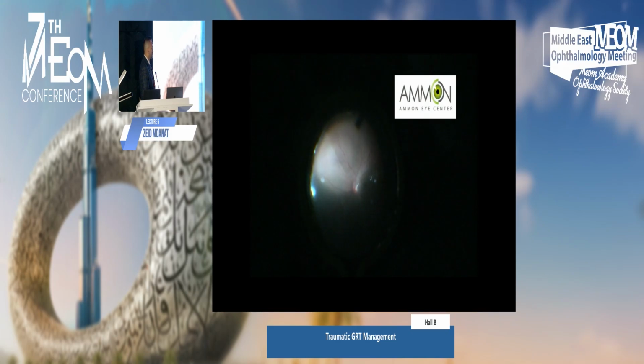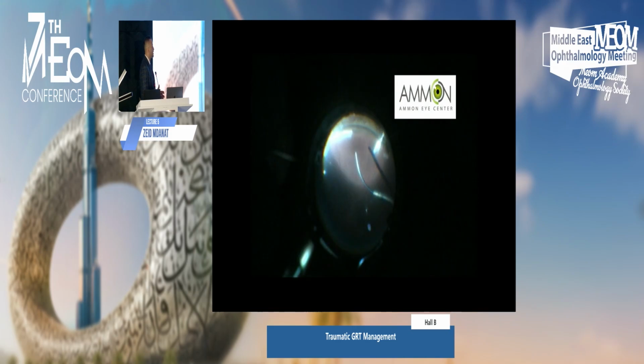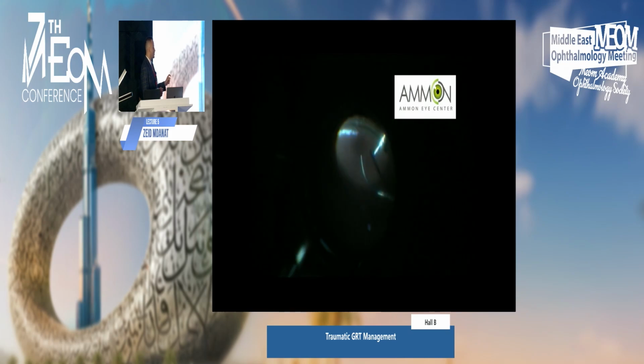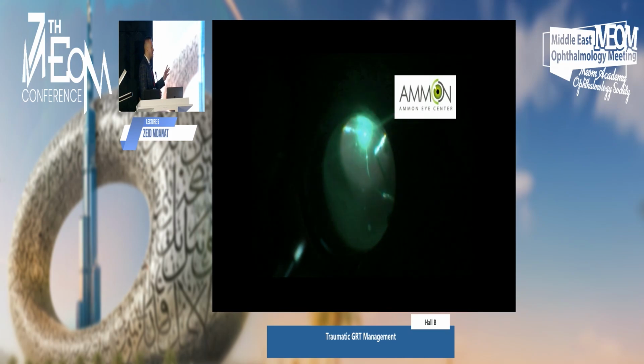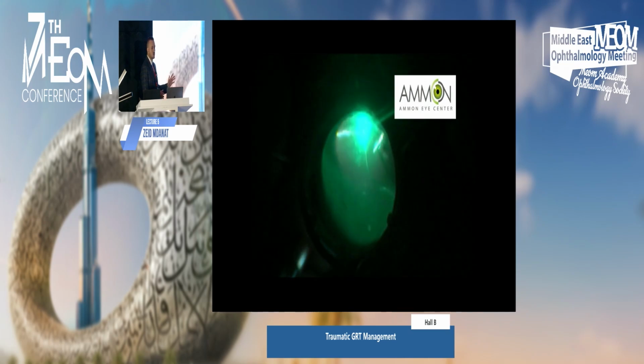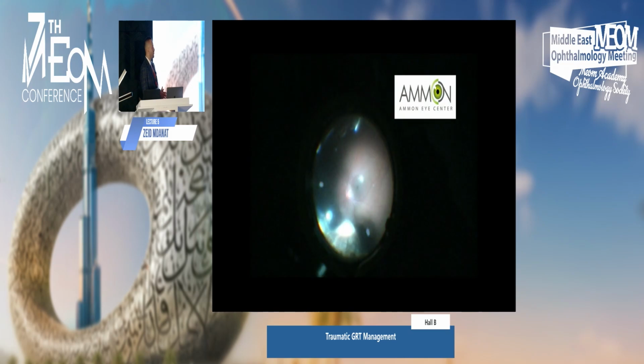So this is obviously me filling the eye gently and slowly with the PFCL, and now doing a couple of laser rows. I think 2 laser rows across the area of the GRT is enough. You don't have to do heavy laser. Remember, these patients are prone to get PVR. They're at high risk to get PVR. You don't want to be doing excessive laser to increase the risk of PVR.